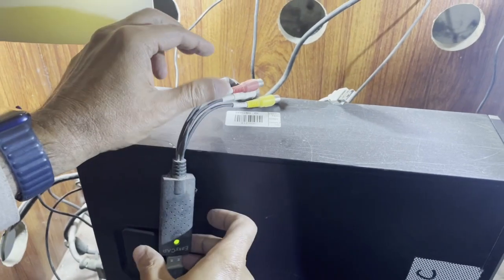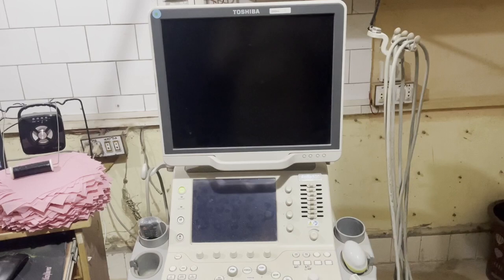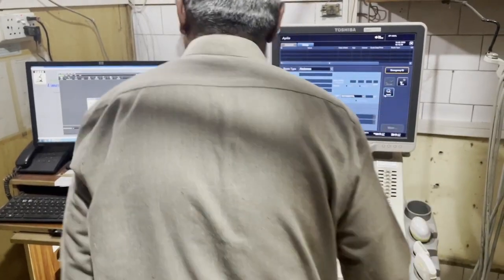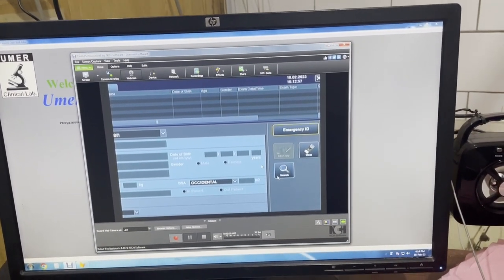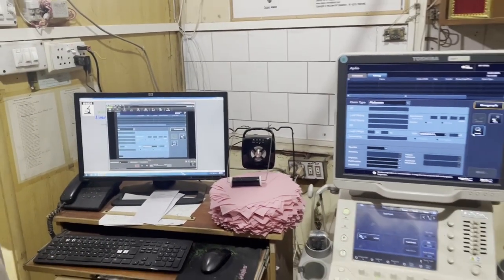Now power on the ultrasound machine. The ultrasound machine has been powered on. On my computer I click the NCH video capture software, and now you see that the image displayed on the ultrasound machine has been captured on the NCH video capture software.